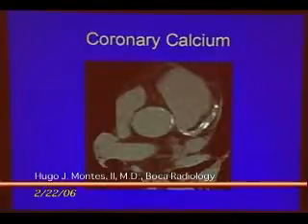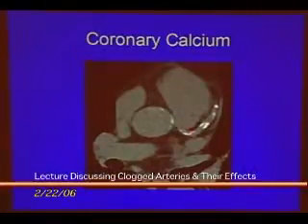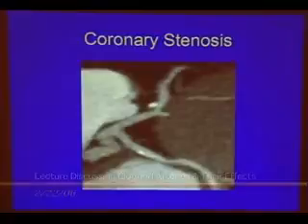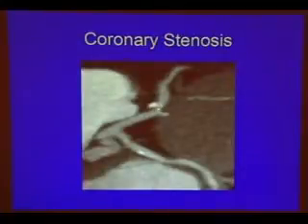Now, the question is, is calcium good or bad? Well, typically it's not good. I'm sorry, it's exactly not good. And the question is, is this calcium associated with potential severe stenosis? So in order to determine that, we inject the contrast material, and we determine if the calcified plaque is the one causing the stenosis or not. By stenosis, I mean narrowing of the lumen of the artery. Now, in this case, for example, we see a little bit of a plaque here, which has some calcium, and there is a little bit of narrowing of the artery.